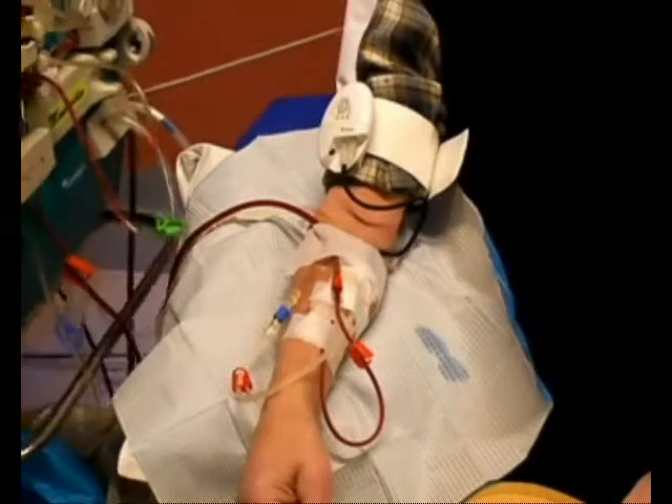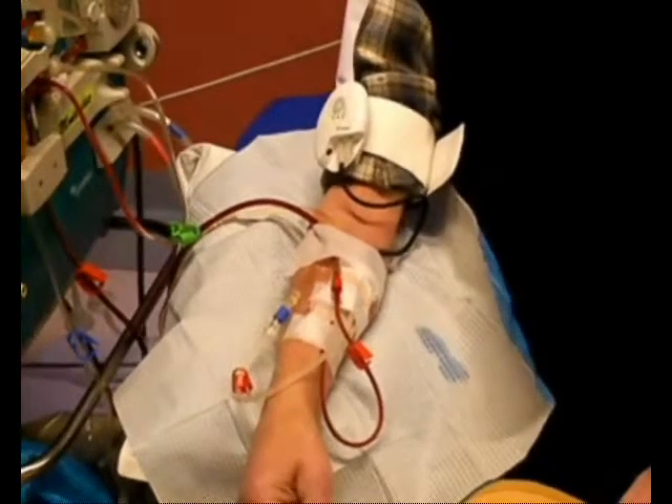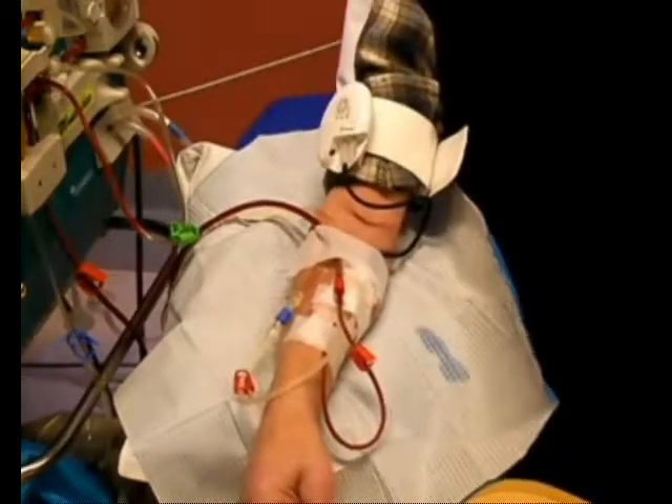When the green light is completely lit, the alarm is operational. The monitoring is functioning in the correct way and the dialysis can begin. You should follow normal safety procedures such as making sure the patient doesn't interfere with the alarm unit.